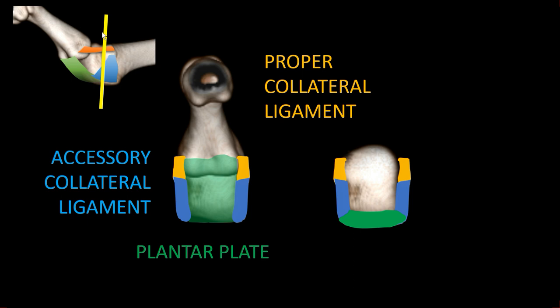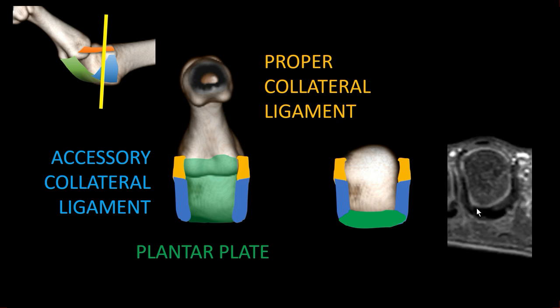If you do a cross section at this level it looks like this. We have the plantar plate here, the accessory collateral ligament here in blue, and then the proper collateral ligament. So you can appreciate the plantar plate and these collateral ligaments — the accessory one and the proper one.